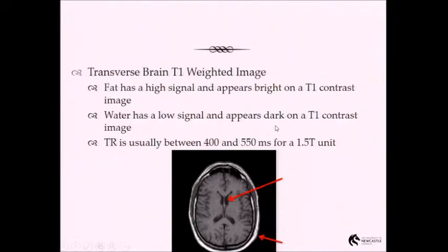So you have to spatially encode. Remember I spoke about how many phase encoding steps, so we have to get that done in a certain time. So the more slices, the more times we have to turn on our slice select gradient to carve the brain up into that number of regions.